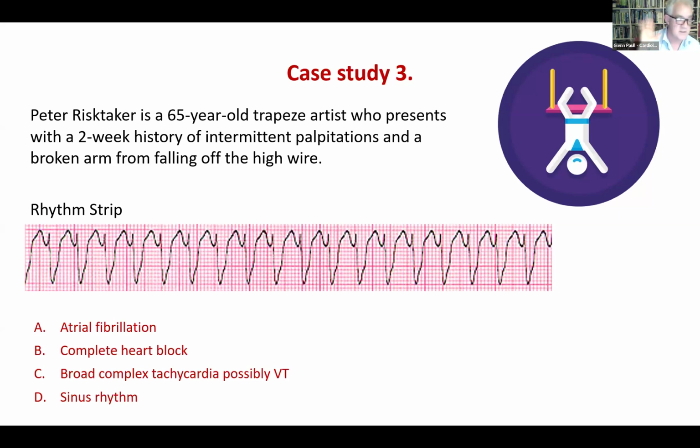That's just a computer algorithm which they put in. It's an international standard, and a lot of the ECG machines will use that. It's called the Glasgow algorithm. It's not the Glasgow coma scale, it's the Glasgow. So a lot happens in Glasgow.